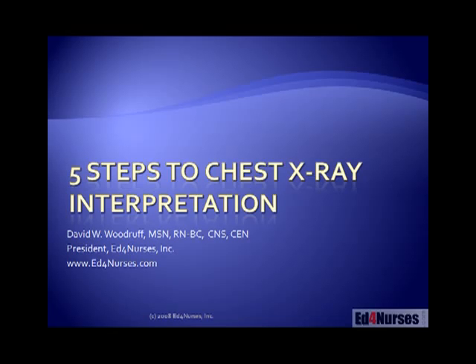Okay, I know that was brief, but use those 5 steps to assess your patient's chest x-rays. Hopefully, it'll help you to pick up some things that you might be able to use in your practice so that you can start looking at them and getting more information about your patients.